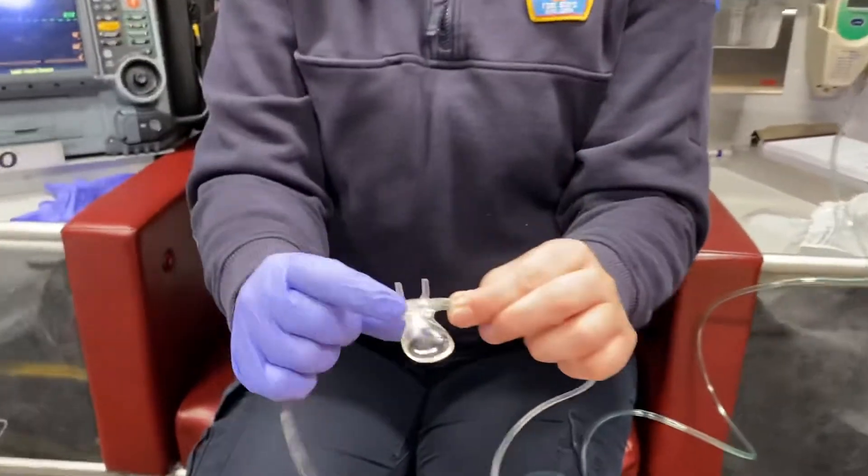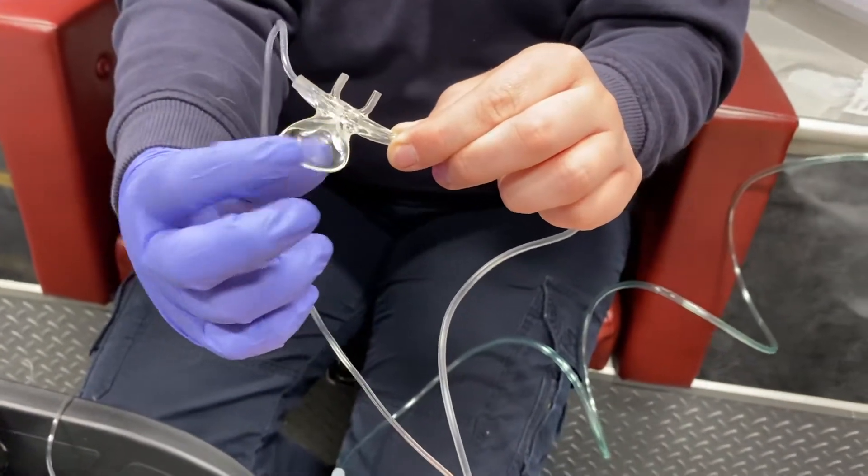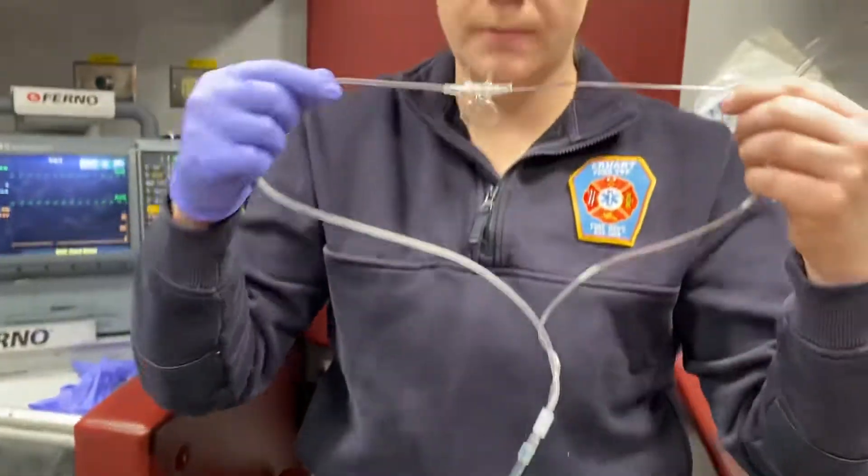Also, this reservoir is going to catch their exhale, so you want that reservoir open to their mouth. When you put it on your patient, just put the prongs in their nose, the loops around their ears, and then you can tighten it for comfort and to make sure it doesn't fall off.